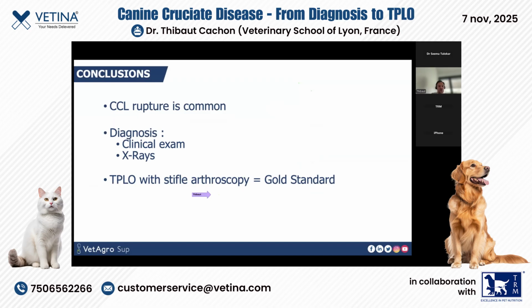I always do a TPLO with a stifle arthroscopy to confirm the diagnosis, but also to evaluate the meniscus and to treat any meniscal tear at the time of diagnosis. I do more or less 5 to 6 TPLO every week, and I'm very confident with the surgery, and I think that TPLO is the gold standard of cruciate rupture treatment.